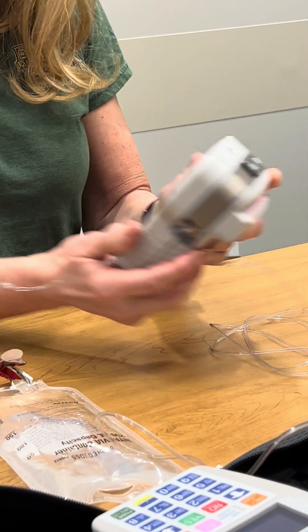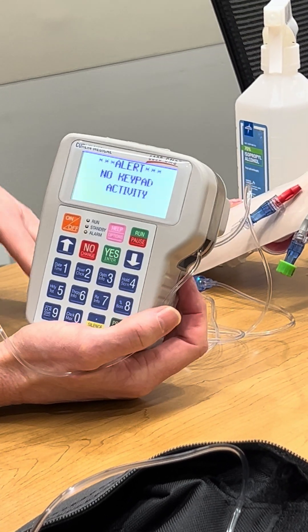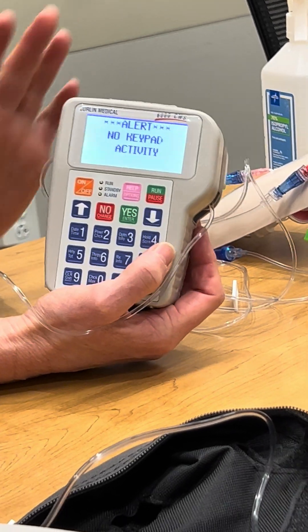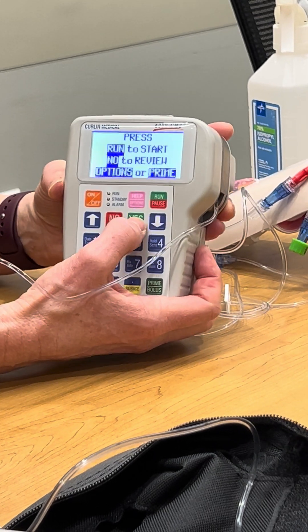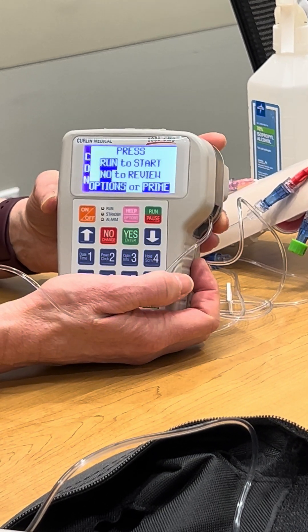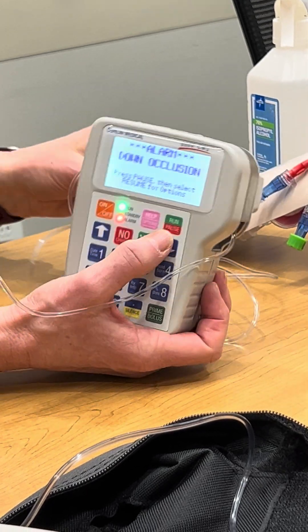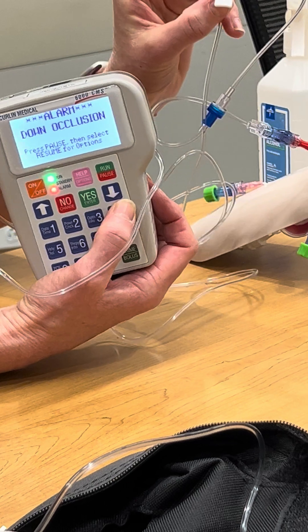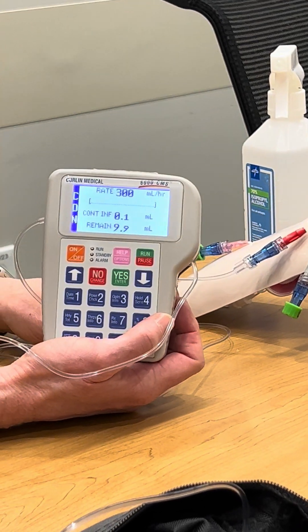Don't be alarmed if you get this message on your screen: 'no keypad activity.' It's a safety feature — if you're not pushing start within 30 seconds, it's going to let you know that you forgot to push start. Now we're ready to start, so I'm going to hit the run button. A common occurrence is forgetting to open your clamp. This is a slide clamp — I'm just going to slide that, and it's going to start running again.